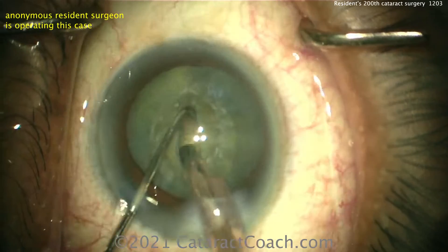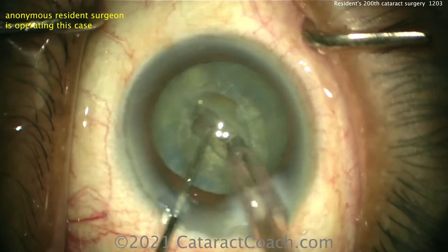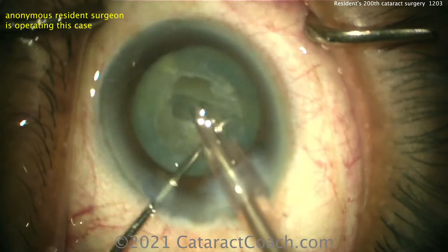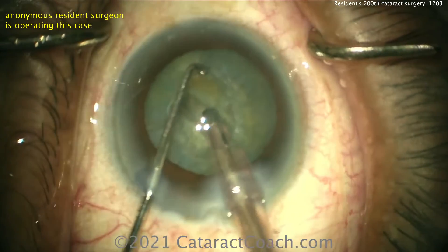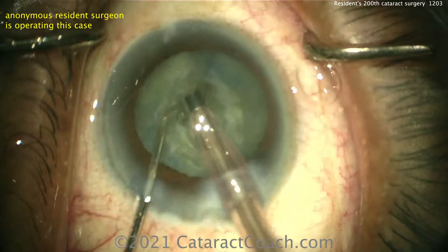Let's see what's going to happen now — a crack in half. There's a good crack propagating all the way through. I like that technique. Remember, you want to be careful to really propagate that crack all the way through. Looks like a horizontal chop — nicely done.